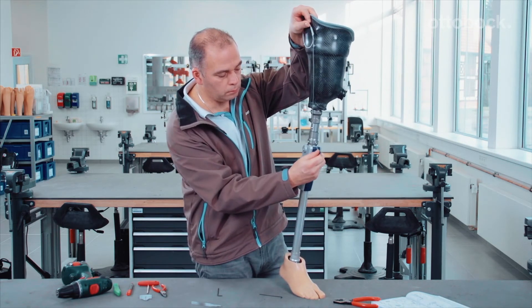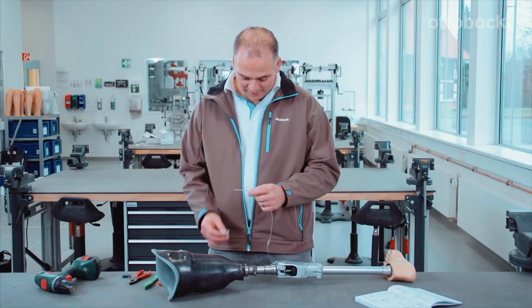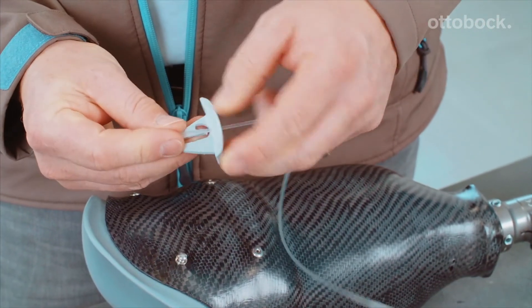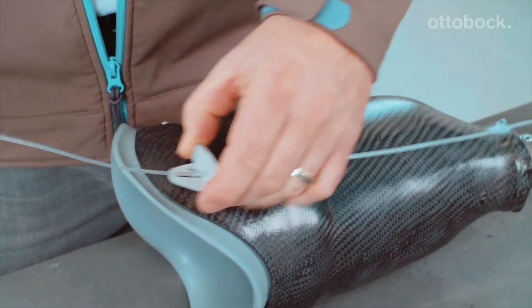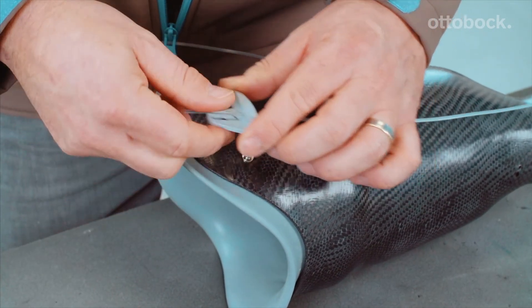The lock release cable routing of the Procedo has now been successfully adjusted and the lock release cable can now be installed. Please mount the lock slide as usual now. All of the instructions can also be found in the instructions for use.